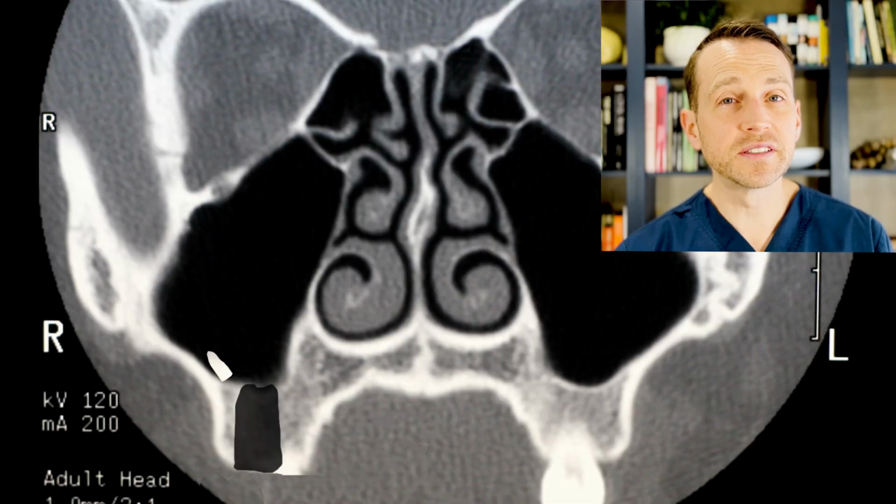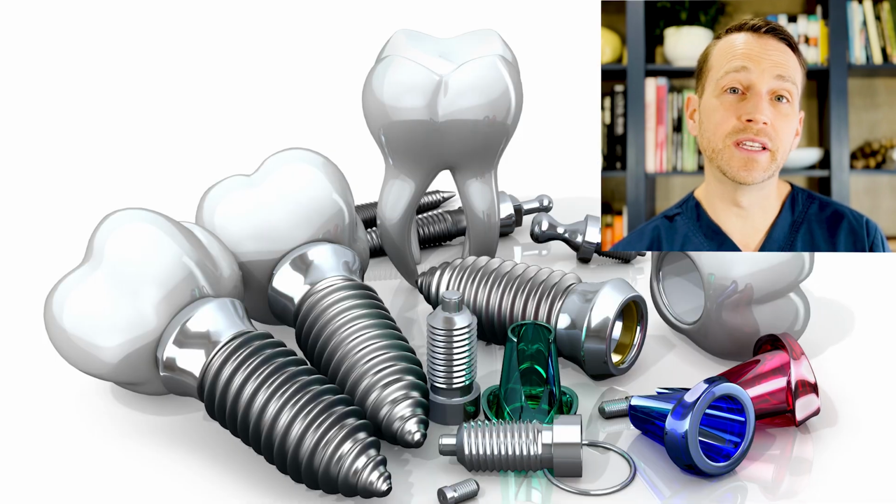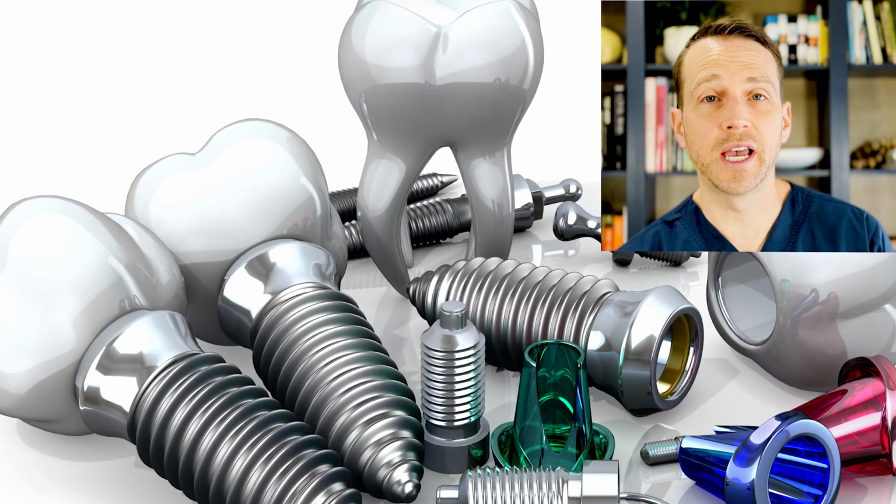Bottom line, if you remove enough maxillary teeth, eventually you're going to have this complication. It's just a basic fact of human anatomy. Fortunately, this is a very manageable problem, and the chances of a post-operative morbidity are low if the root is retrieved and the site is closed appropriately. Even though this example is about a displaced root, the same protocol also applies for a displaced implant or other foreign body into the maxillary sinus.